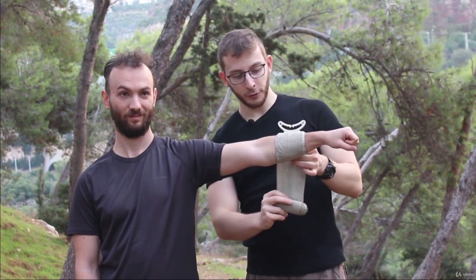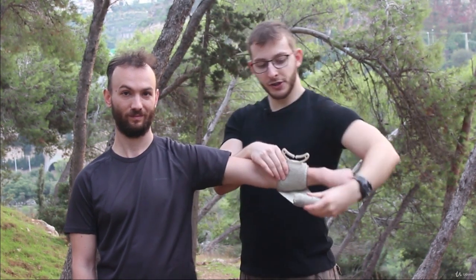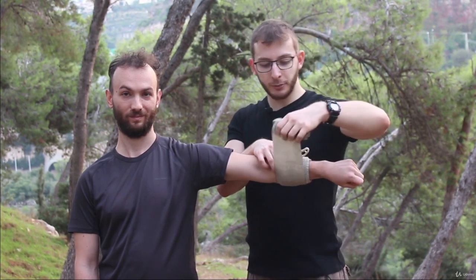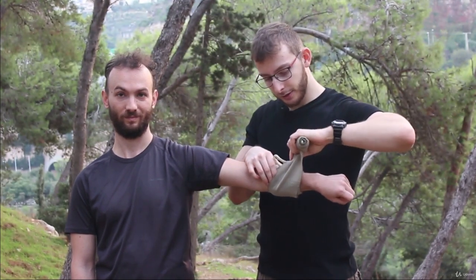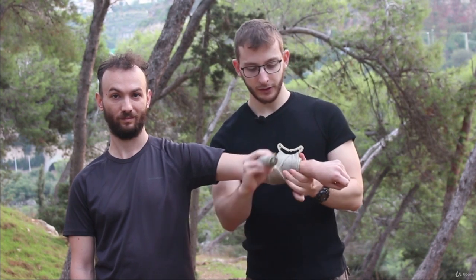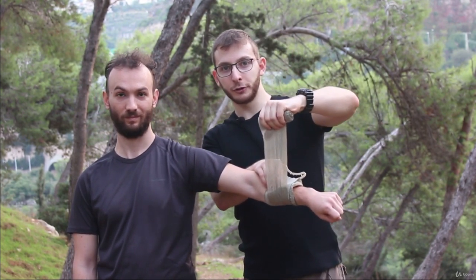And now what we want to do is just wrap it around. You see there's a plastic device on top of it. We want to take the bandage and insert it inside, like this, once, and twice. Make sure that you yank it so it will create pressure.